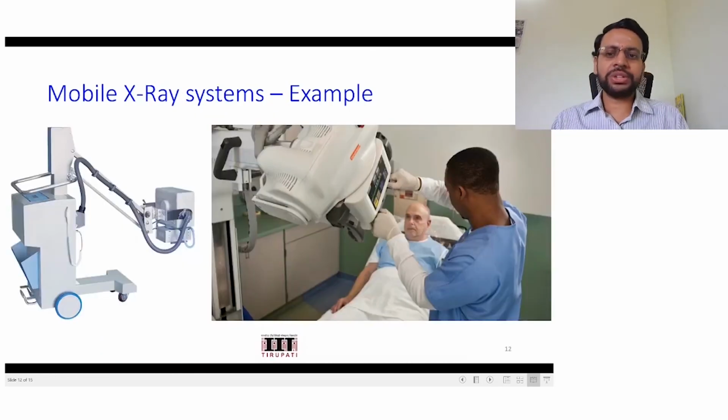Another specialization of X-rays, as we were mentioning, is where the patient is not mobile, so the whole X-ray system has to be in a way that it could be moved. For example, you would like to monitor how the lungs are functioning for a subject. One difference I would point out here, but will not go into detail right now, is that this is taken in anterior to posterior for observing the lungs because of the constraints in moving the patient.